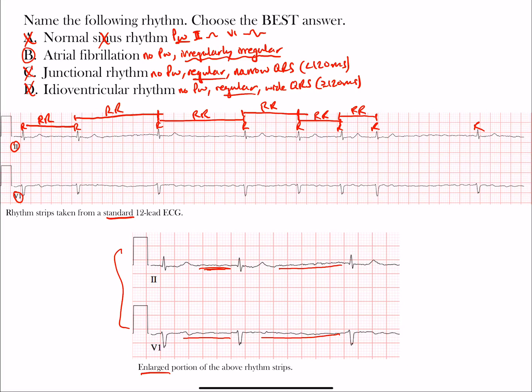That leaves choice B. This is a case of atrial fibrillation with chaotic atrial firing and no clear P wave activity. You may see fibrillatory waves at the baseline — this would be called fine atrial fibrillation. It's an irregularly irregular rhythm. Junctional and idioventricular rhythms have no P waves but are regular, and are further distinguished by QRS width. Junctional rhythm typically has a rate of 40 to 60 beats per minute.